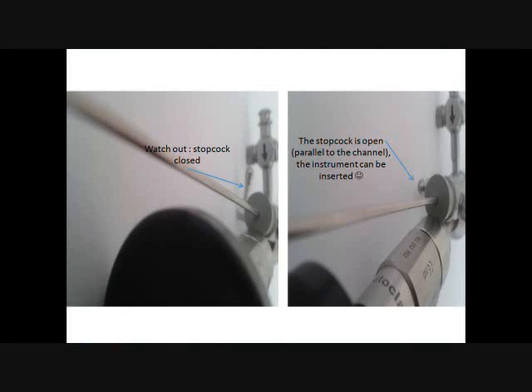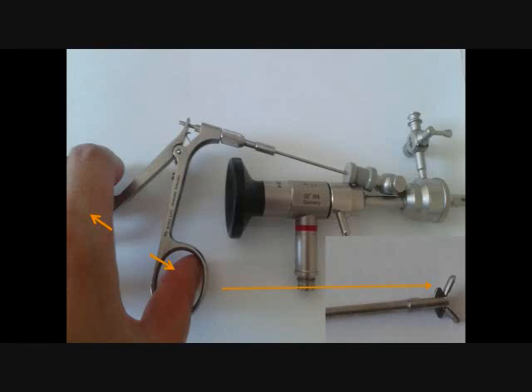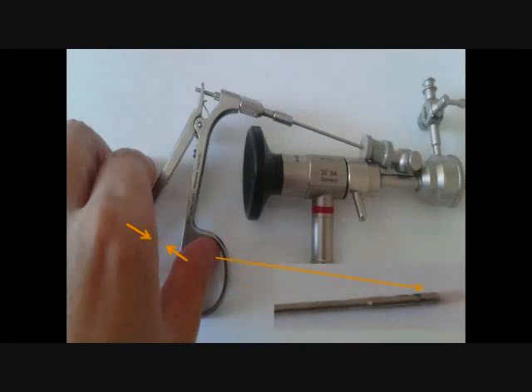And I also want to draw your attention to the stopcock that is available on the entry of the working channel. Take a look at the left. The stopcock is closed. See, it's perpendicular, so we cannot insert the instrument. Whereas in the right picture, the stopcock is open. It's parallel to the channel, so the instrument can be inserted. Here's an operating instrument inside the working channel. We open the instrument and see here a biopsy forceps, it gets open. We close it and the biopsy forceps is closed.